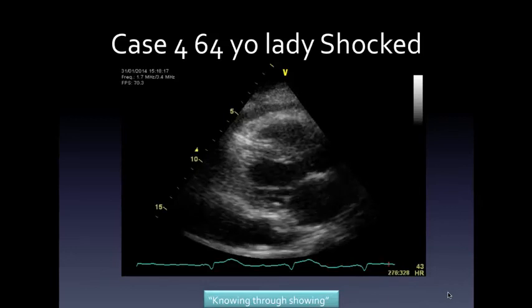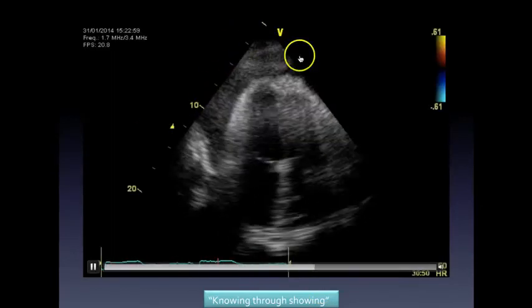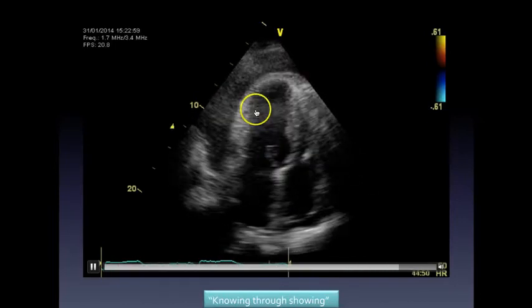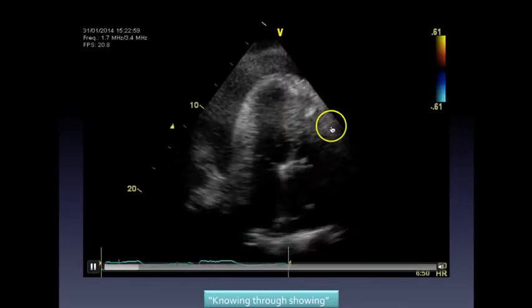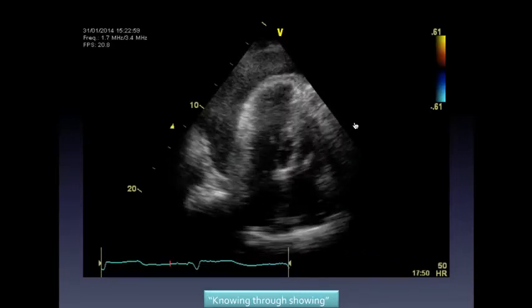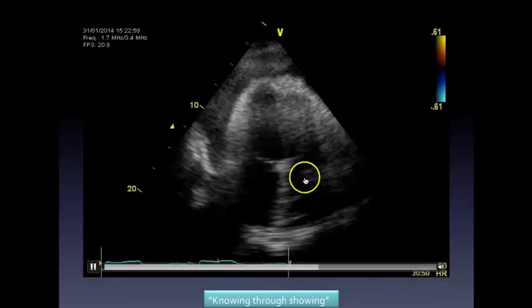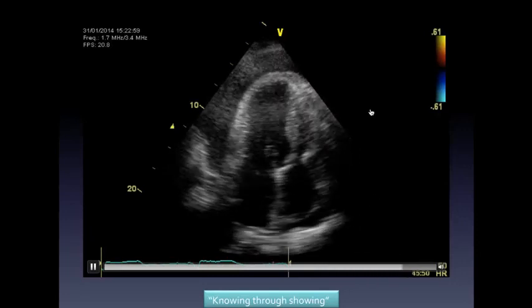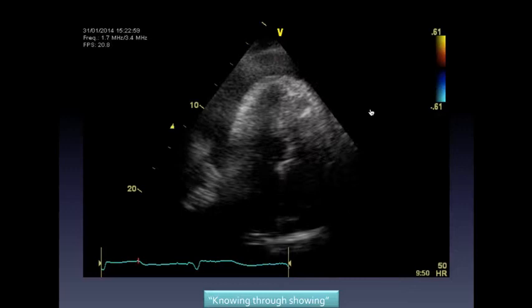Very good. So in the shock, you have a heart that's floating. So again, I know we're talking about ejection fraction, but the big picture here is, is her ventricle entirely normal? Probably not. She's got pacing, you got that dyssynergy, which is harder to see. So that same dyssynergy that you saw earlier isn't as evident if you've got pericardial effusion. All right? So she's got a big pericardial effusion. She's got right atrial collapse, which doesn't always give you hemodynamic compromise, but she's actually got right ventricular collapse. Okay? So this was a shocked lady, treatment very straightforward, pericardiocentesis, cardiologist on call that weekend, and all was well.